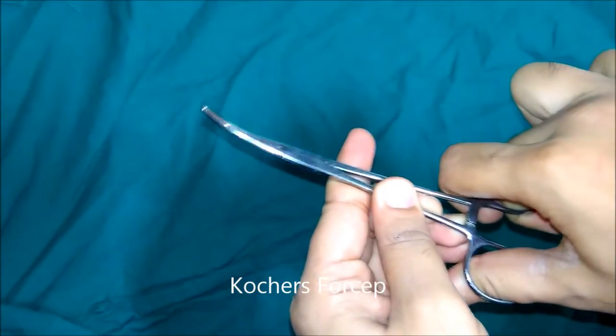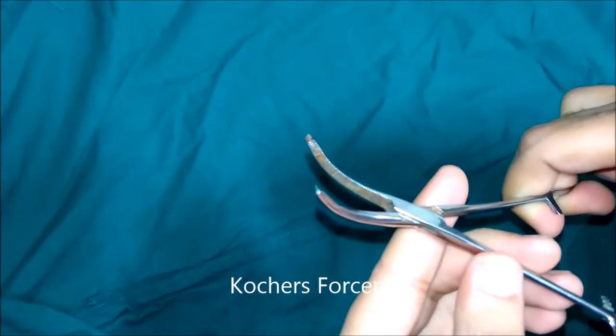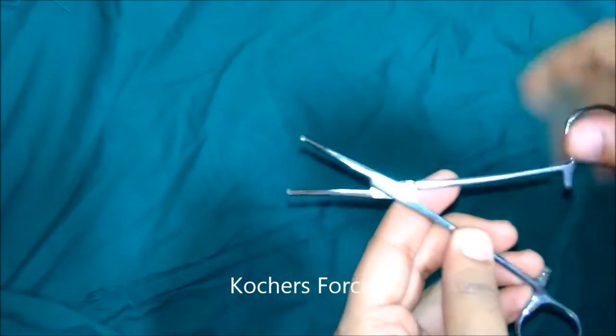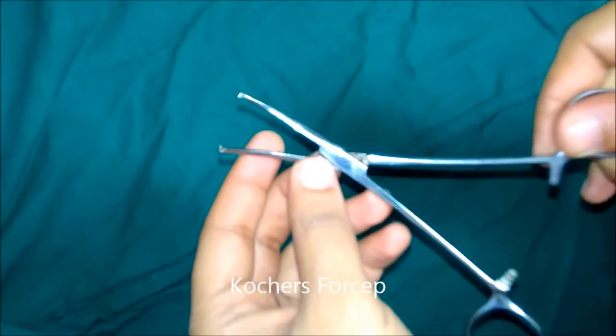This is Kocher's haemostatic forceps. These forceps have a tooth in one blade and a groove in the other blade. This type of forceps is suitable for holding vessels in tough structures like the palm, soles, and scalp.